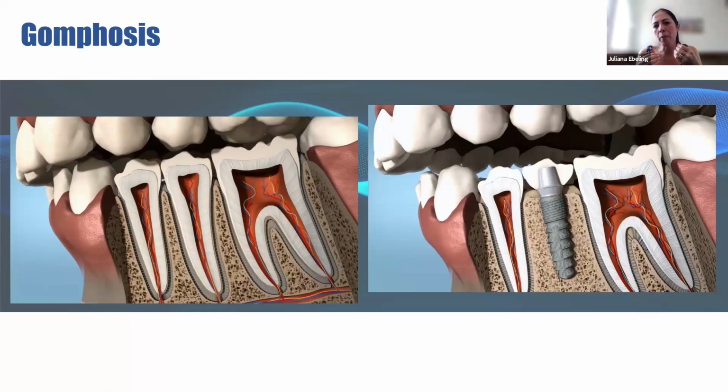So mainly in oral rehabilitation, OccluSense helps us a lot to make decisions based on the intensity of these contacts, and then deliver to this system a better balanced distribution of force, not only contact distribution, but the intensity of this contact.